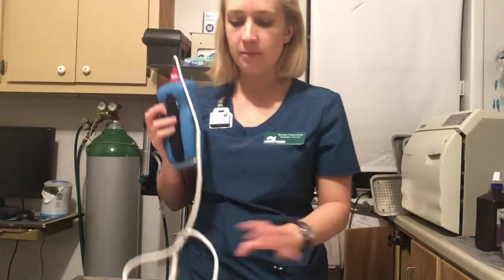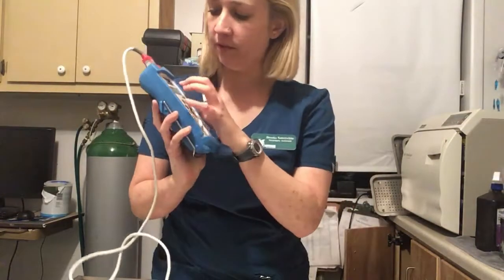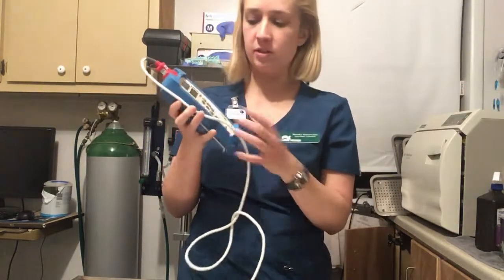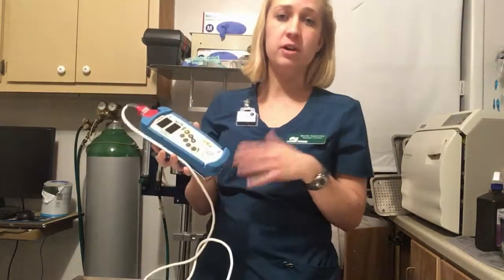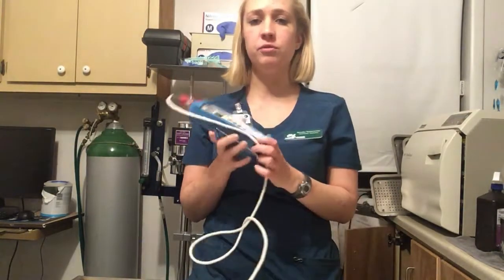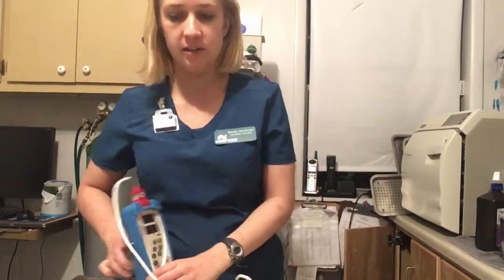So the first thing that I'm going to go over is our pulse oximeter. We have this system here. It will go over the percentage of the oxygen that is in their system, SpO2, as it's also called. It'll tell us their heart rate. It'll also have an audible sound of their heart rate as they're under anesthesia. It'll have an alert whether or not their heart rate is going too high or too low, or whether or not their oxygen percentage has gone down below 94%. So that's what that is going to test.